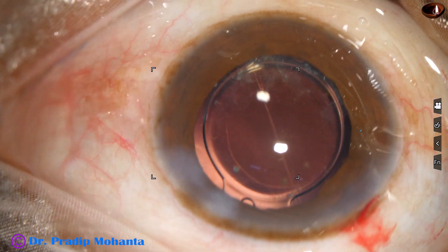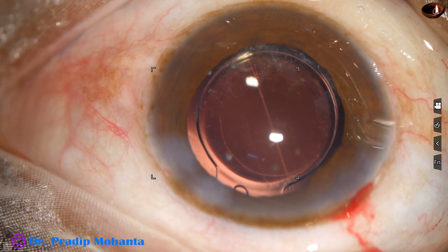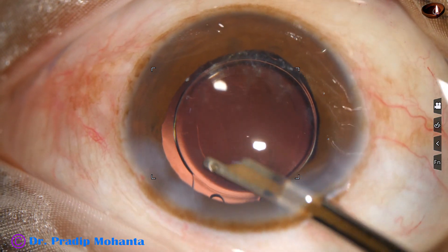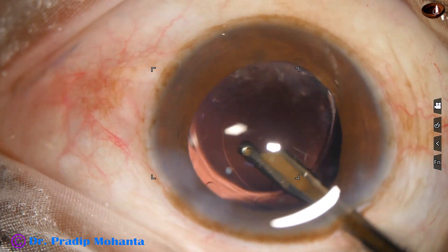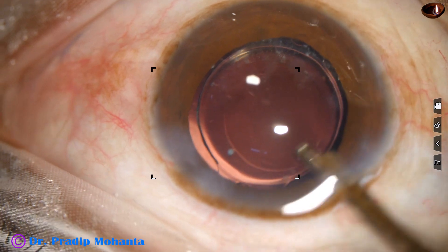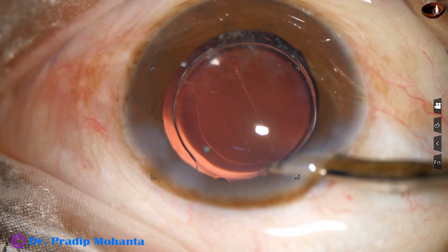The side port is closed by hydrating the corneal stroma on either side of the stab wound. This is the final lavage of the anterior chamber — a gentle stream of BSS goes towards the corneal endothelium and removes any visco sticking to the corneal endothelium.